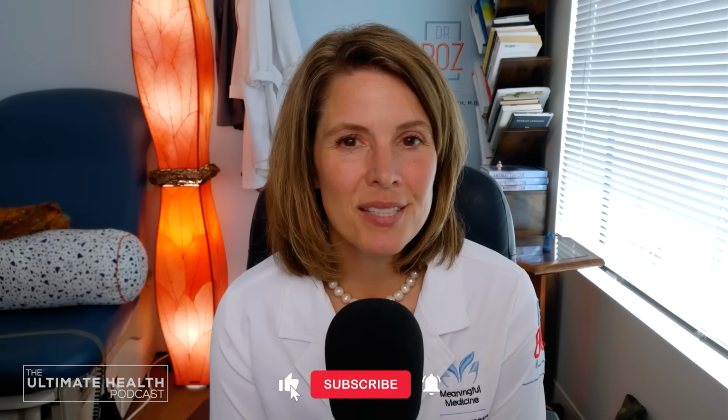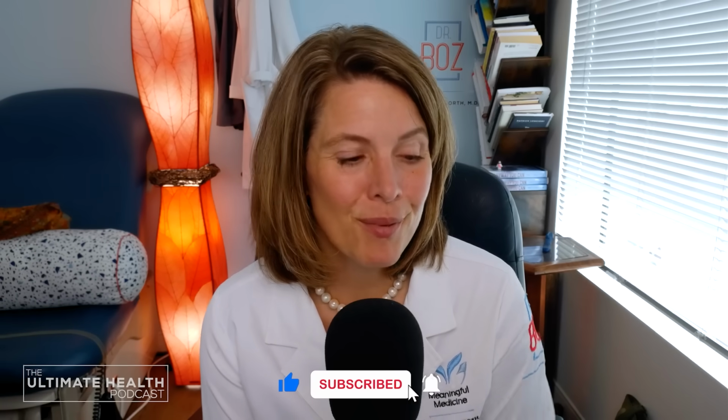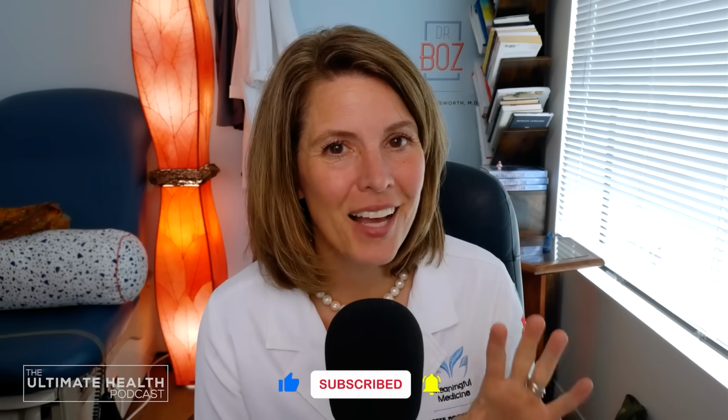You know, and even the 0.1, 0.2, I would say is a statistical error. The meters are great, but they do have a plus or minus 0.4 for their accuracy zone.